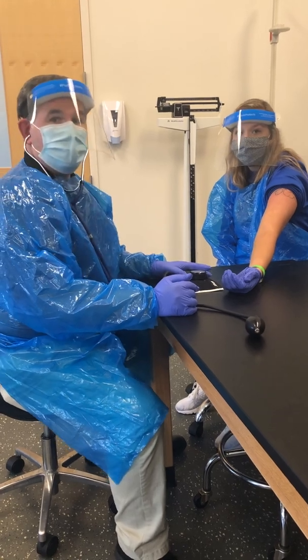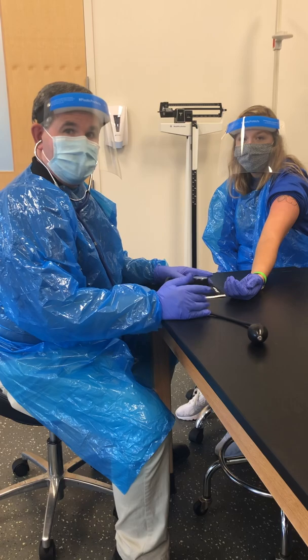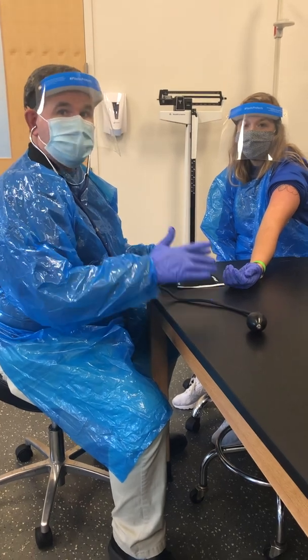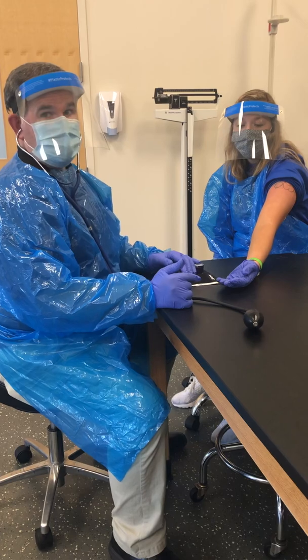Today, I'm going to be going over blood pressure assessment. We're going to be using the obliteration of pulse as the standard. The first thing, our subject here has been sitting for a 5-minute period of time, relaxed with her feet firmly on the floor. Her left arm has been on the table, avoiding isometric contraction.